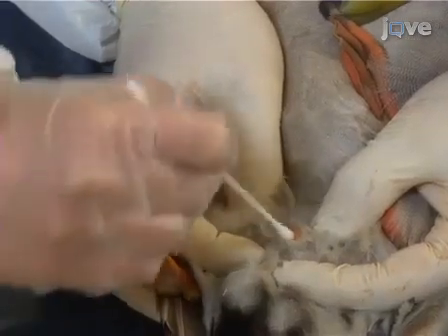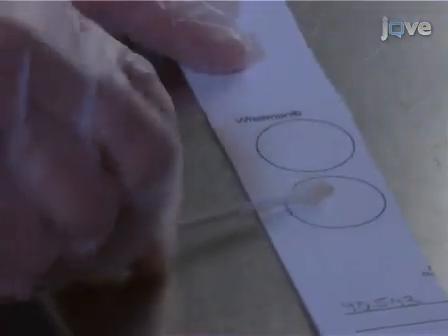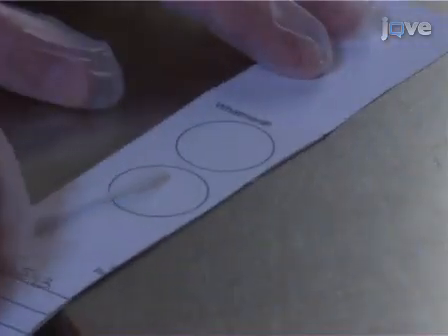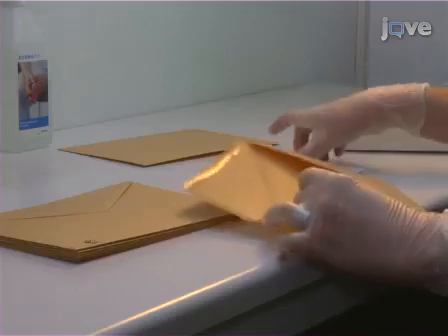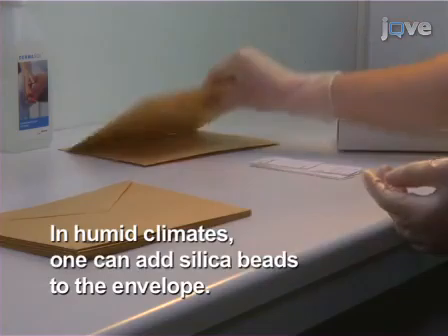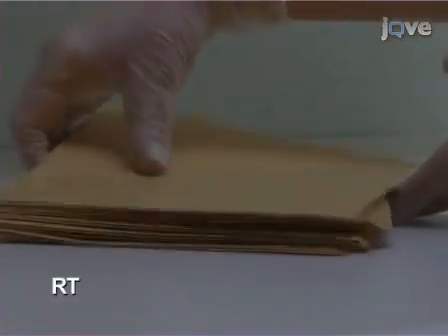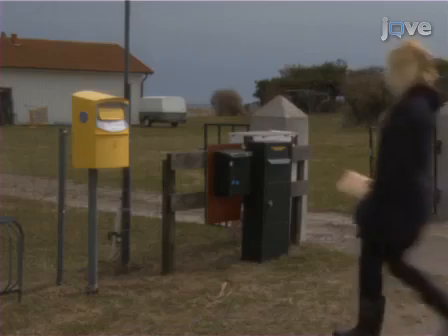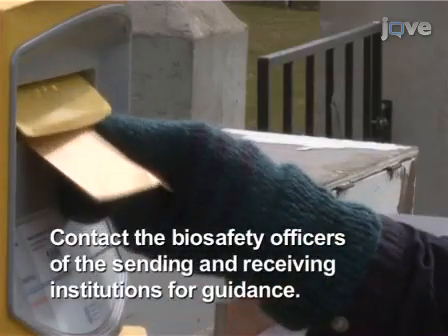Carefully insert a sterile plastic rayon swab, approximately 1 cm, and make a gentle swirl of the cloaca. Remove the swab, then roll it over the surface of a Whatman FTA card. Dry the FTA cards at room temperature for at least 1 hour. Place each sample in a paper envelope. Then, store the envelopes at room temperature for short-term storage or freeze them for longer periods. FTA cards can be sent by regular mail since the pathogens become inactive upon contact with the FTA card surface.